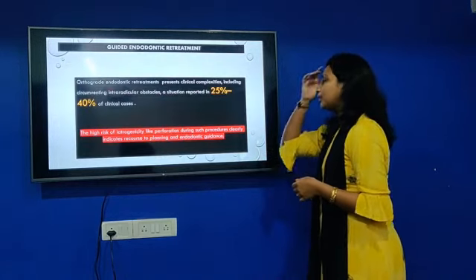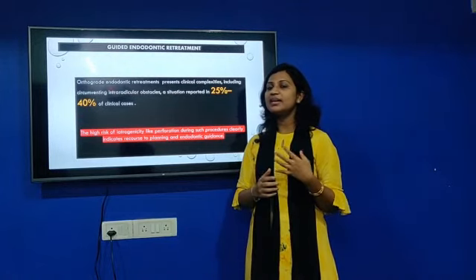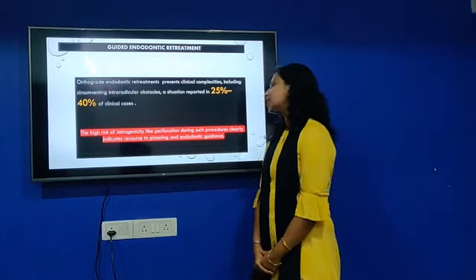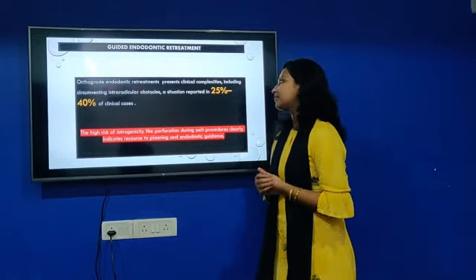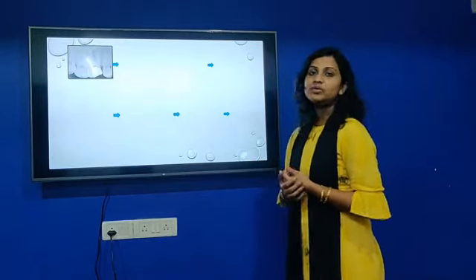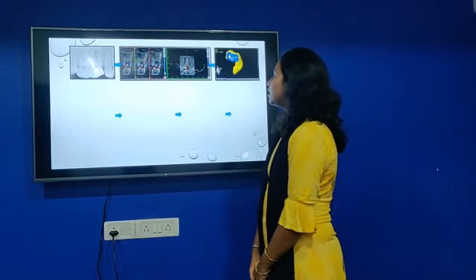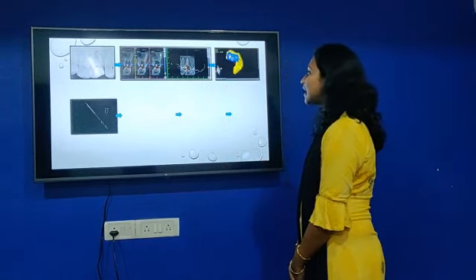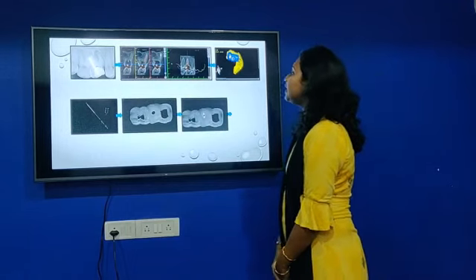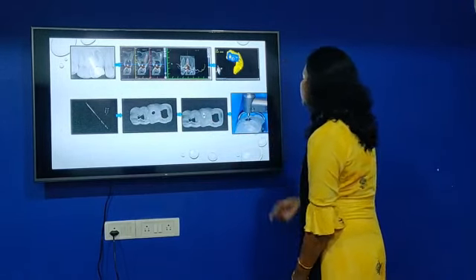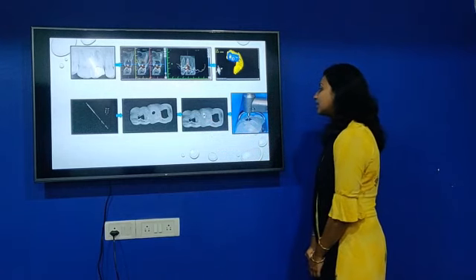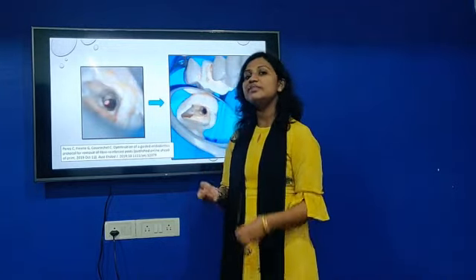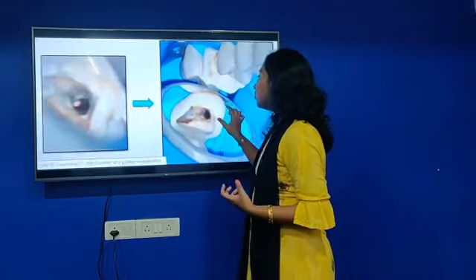We are going to look at guided retreatment. Retreatment is one of the challenging things, and when fiber posts are present it makes treatment even more difficult, with risks of perforation. In this case, first an X-ray is taken, the drill is designed, virtual planning is done, and then the guide along with the guide sleeve is fabricated. Retreatment was performed using the same bur, and you can see the fiber post was completely removed without any deviation.